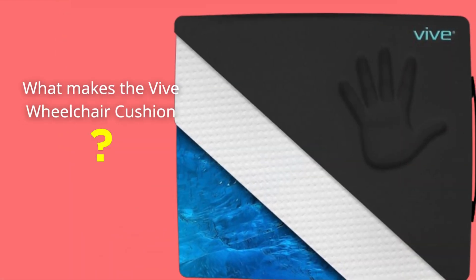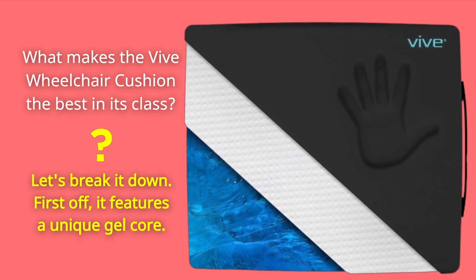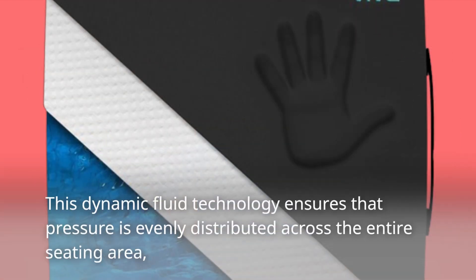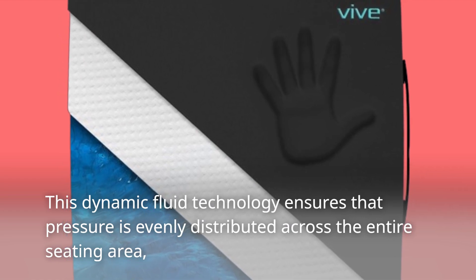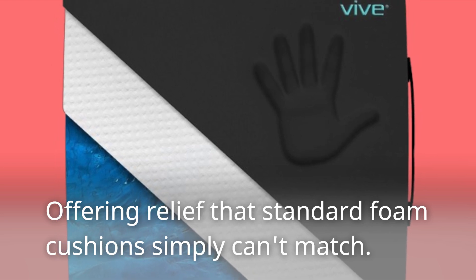What makes the Vive Wheelchair Cushion the best in its class? Let's break it down. First off, it features a unique gel core. This dynamic fluid technology ensures that pressure is evenly distributed across the entire seating area, offering relief that standard foam cushions simply can't match.